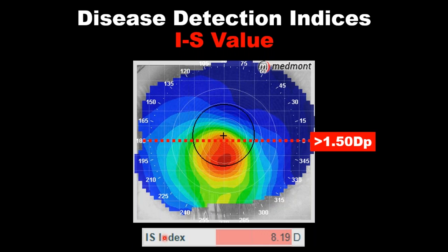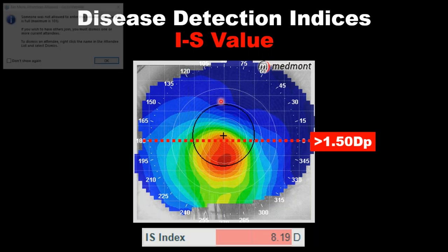The most important one to surgeons that do LASIK is the IS value — what they're looking for is whether the inferior shows steeper curvature than the superior. In this case, the inferior cornea is 8.19 diopters steeper in the inferior hemisphere relative to the superior hemisphere.